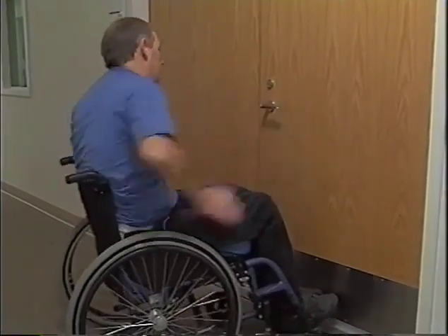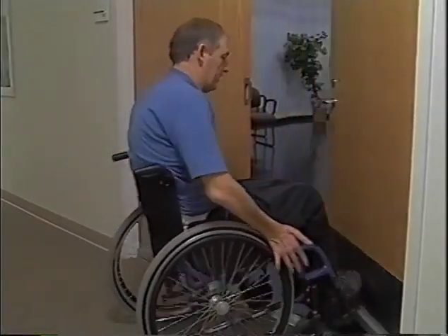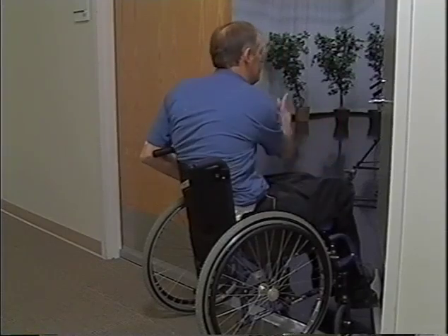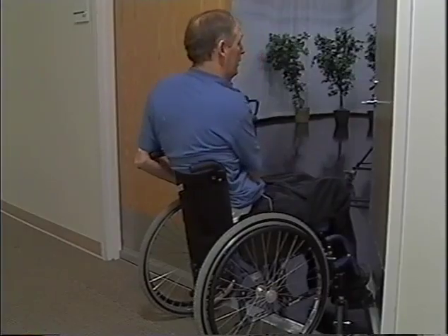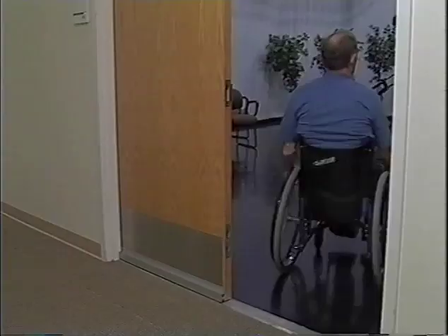I'm going to make sure it's open, and then go back to the wheels and stay on the wheels and just push the door. I'm pushing at a bit of an angle because the door is going to push my front end at a bit of an angle, and I don't want to end up hung up on this other door jamb. So as you can see, the door is turning me, and just push through with your hand.